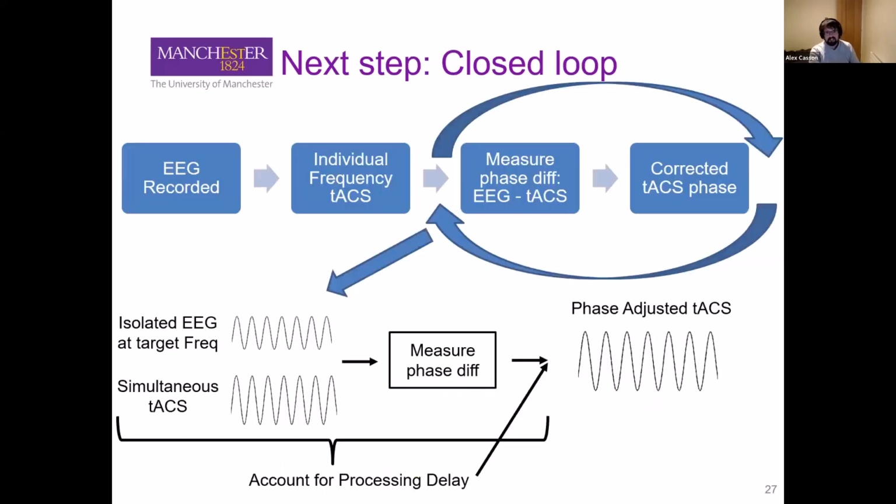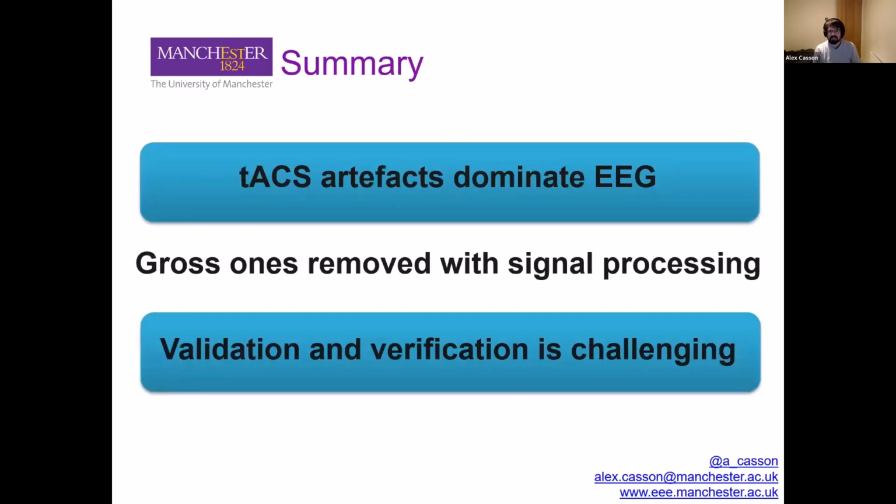And in terms of the next step, we can now do the artifact removal to the level I was talking about. We can do that in real time, and we've got the technology, but not the funding bits in place for doing that closed loop based stimulation, certainly at the max frequency, at the max phase level. And that's all I wanted to go over.